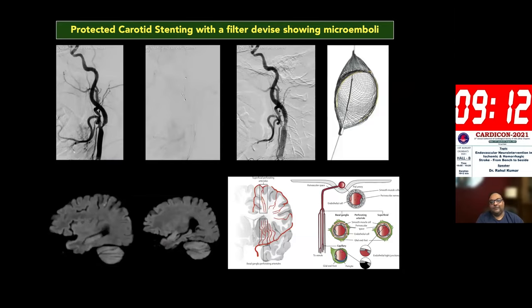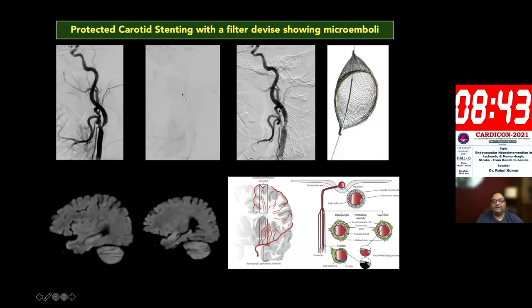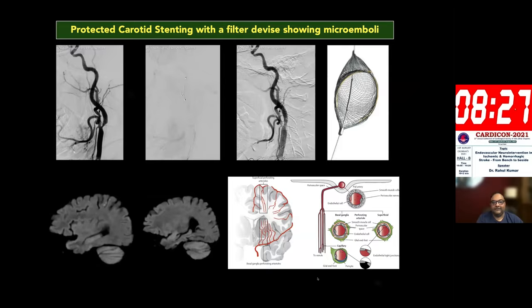Not all clots causing problems are large. A patient presented with recurrent TIA episodes and micro-infarcts in the brain but was recovering spontaneously. On angiography, we found a very tight carotid stenosis sending small showers of emboli. This patient underwent a filter placement in the internal carotid artery distally to capture any debris during the intervention. The entire vessel was dilated and opened with the filter in position to catch any clots, and the patient made a very good recovery.